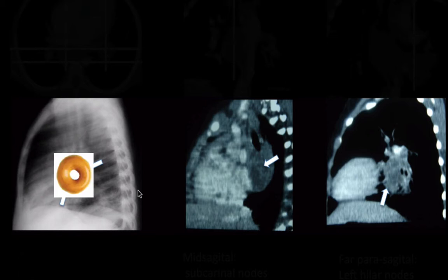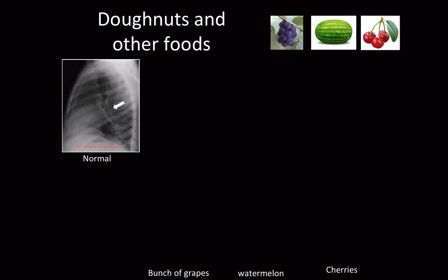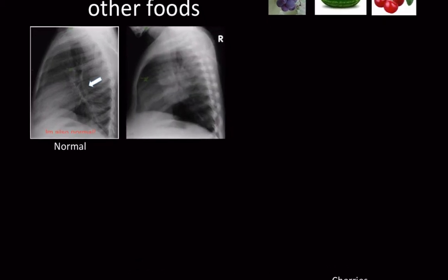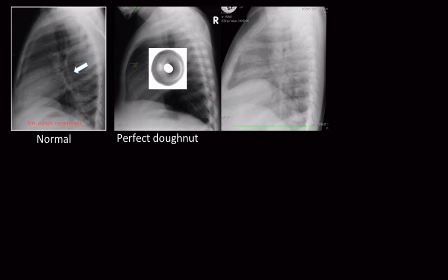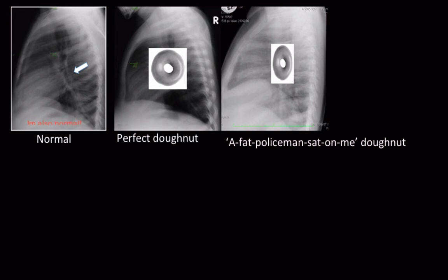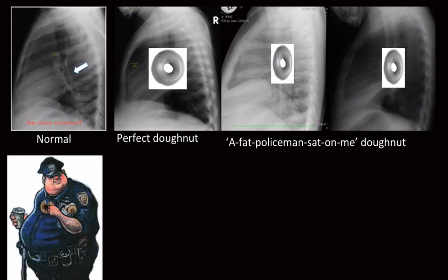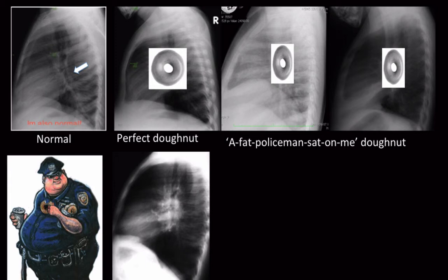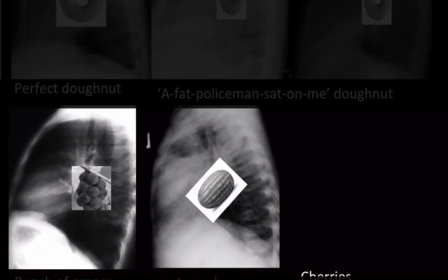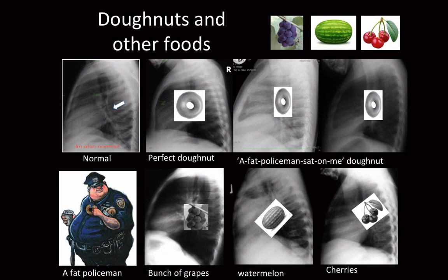There's your donut and there's your donut sign — it's pretty easy. Just to show you that life's not always simple and there are variations: sometimes donuts are not completely round. Of course not everything looks like a donut — sometimes it looks like a bunch of grapes, maybe a watermelon, maybe a bunch of cherries. The key point is that if you're comfortable with where the normal blood vessels should be and you see soft-tissue dense lumps below the horseshoe, then you can call lymphadenopathy.